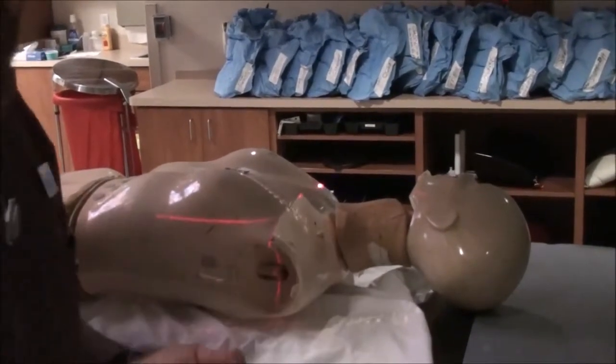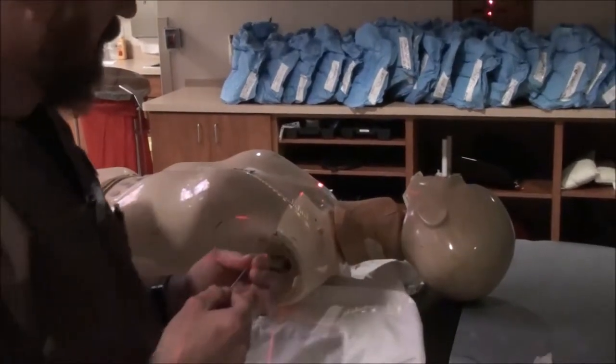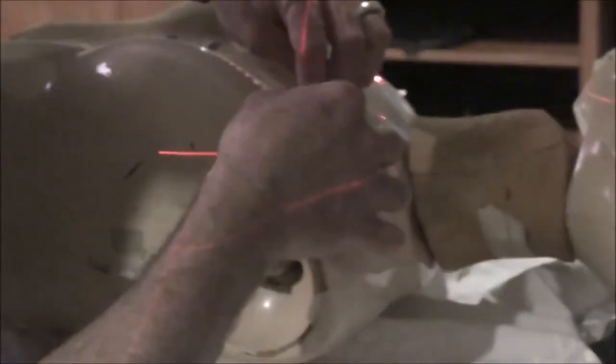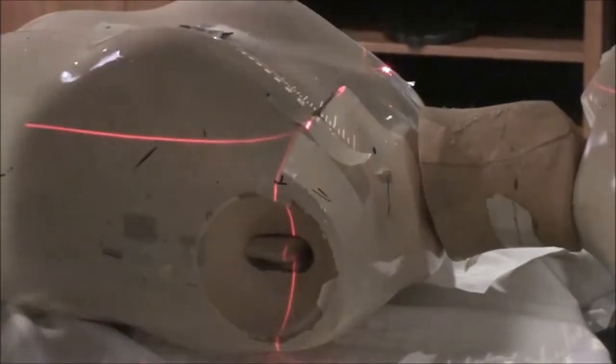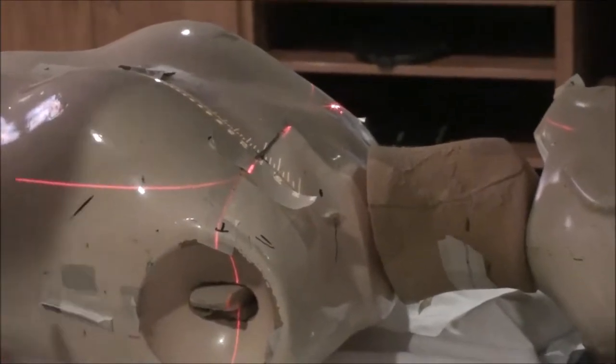Now, if the doctor moved it around, make sure everything is where you wanted it. If it is, great. The next thing you want is a nice flattened-out wire, and you're going to first dot in your border, just like as if you were going to treat this. If you have a match line, you're going to use dots, not one big squiggly line, so that you don't have to wonder where the actual match line is. Lay the wire — theoretically it will be a longer wire than this. Put that wire right along that border. This is going to be your junction point radiographically, so you can see exactly where your divergence from your medial-lateral is going to be. Once we have our wire placed, go ahead and take your film, get it approved, and then we're going to move on to do the breast.